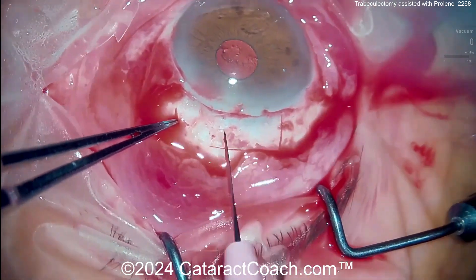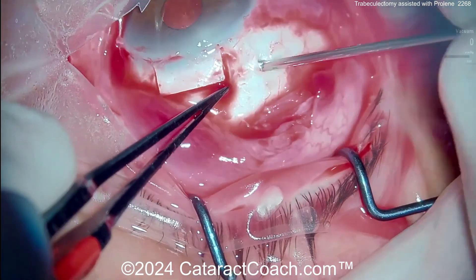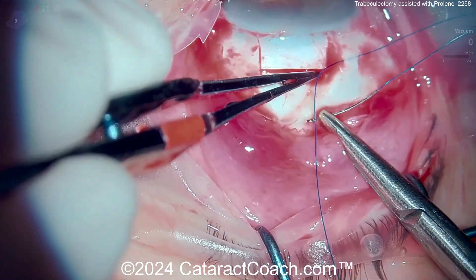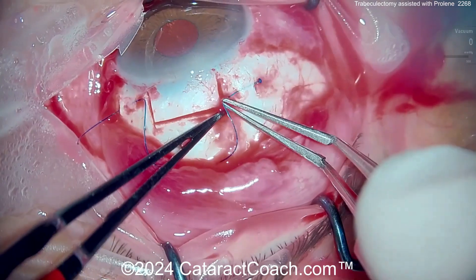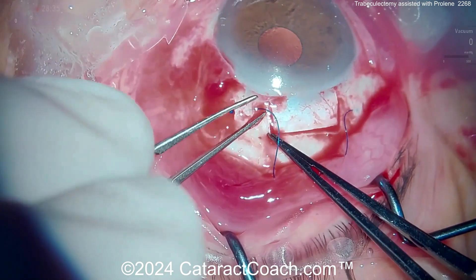Now let's see another technique. Similarly, making a scleral flap here. Now bending a needle to create a little pocket on either side. Here is the proline suture already on the needle — probably an easy way of doing it. Passing that through, then cut the suture, cauterize the ends, tuck that knot in.